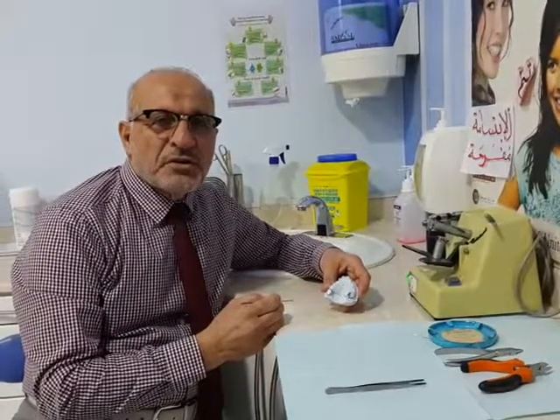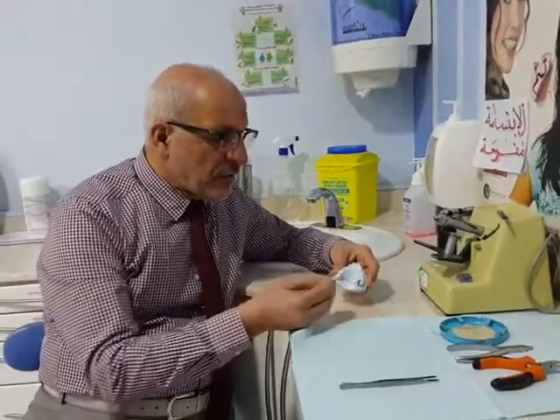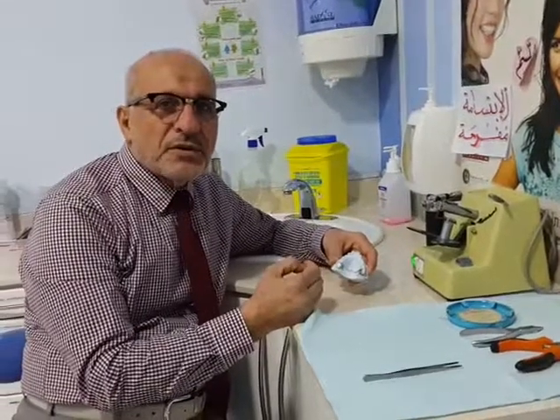Hi, today we will demonstrate the construction of the palatal arch. It has many advantages, one of them is to get extra anchorage between the two molars.